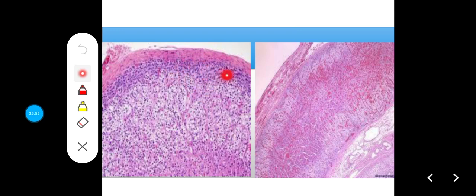You will just find a clean transition from one zone to another, with the middle zone being larger than the outer and the inner zone. Unlike in the pituitary gland, where the pars intermedia is thin and rudimentary, thinner than the anterior and posterior pituitary.